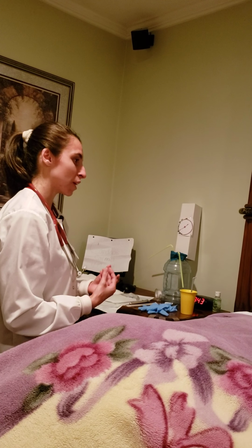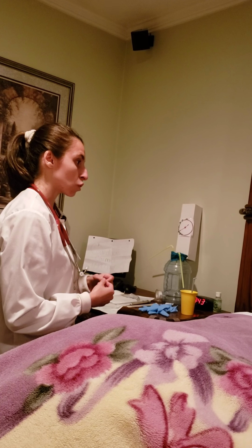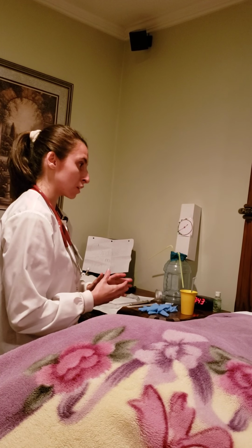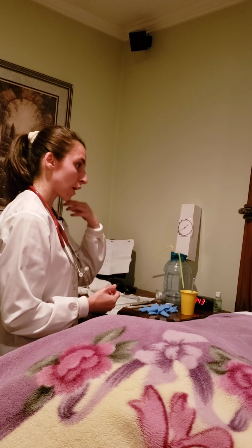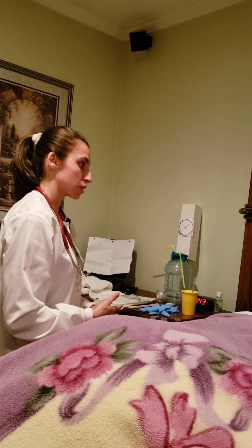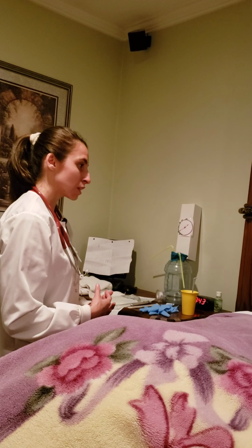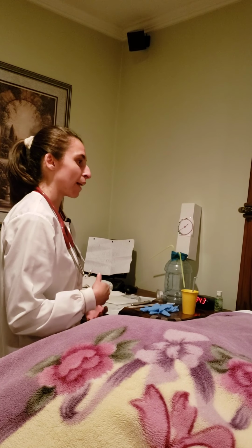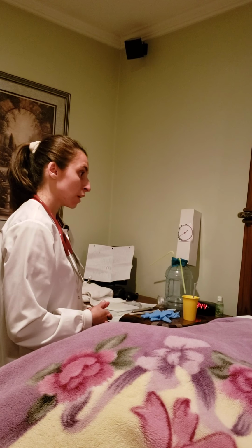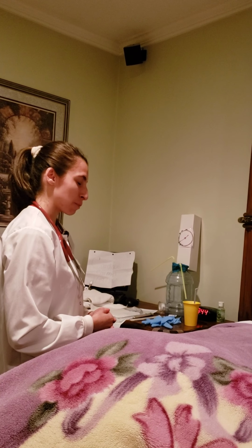So an NG tube is a hollow, pliable tube that is connected to a suction, as you can see here, intermittent suction, and it's going to go through your nose and all the way into your stomach. So once it's at your stomach, it's going to help decompress the stomach. So it's going to remove any secretions or any gaseous substances, and it's going to help relieve that abdominal distension. So it's going to help decrease that bloating. Do you have any other questions? Why is this happening to you?